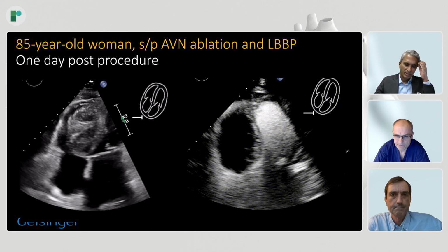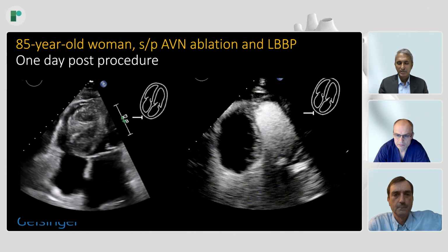So I think one of the reasons is that this particular patient was on triple therapy, so that may be an added issue. But deploying the lead too anteriorly or too posteriorly, where the larger perforators are, especially in the proximal interventricular septum, is something to be avoided. But I've seen published cases even with the lead placed somewhat more distal towards the apical. It's just the unfortunate occurrence of arterial perforators and our lead meeting that perforator and causing the bleeding. In this particular patient, we were able to manage conservatively.